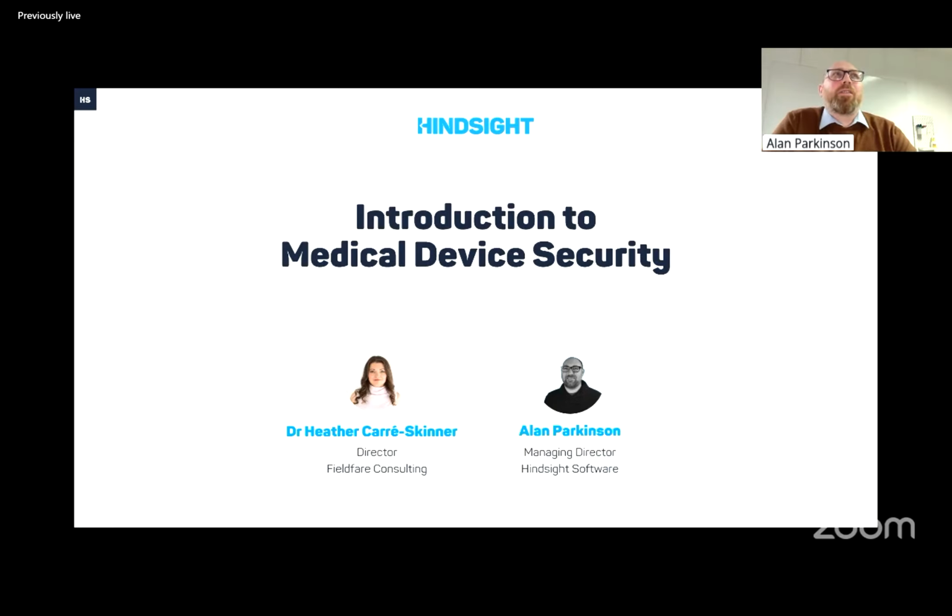So in cybersecurity, there's something called pivoting. That's where I can use a vulnerability in one piece of software to get access to something else, and then I find a vulnerability in that, and I can chain these vulnerabilities. Say I could use a vulnerability in a medical device to get into a hospital's network and get a certain level of privilege on that network, and I could do something else with that. That's quite an important one.